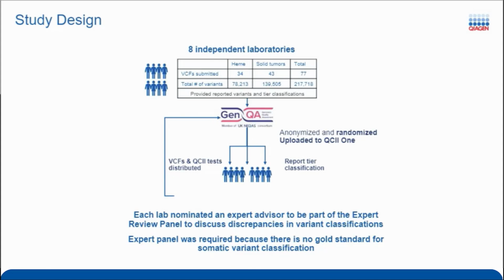Thanks. Yeah, the computer has to make a decision, binary, 1 or 0, on any given thing. While individuals are assessing that data in the background even for the computed version, the computed classification is the computer's. Having that additional second opinion incorporated within QCI1 allows the human to then review all the literature together and make an assessment that sometimes may differ from what the computer was able to come up with. So having both, I'm glad Jenni also agrees that was helpful.